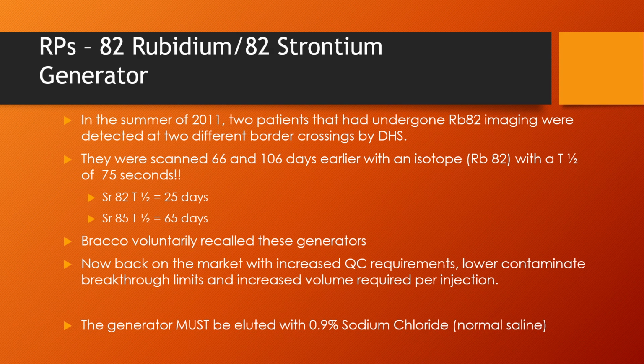The Bracco cart has a scanner that goes with it that you actually have to scan the saline. The system will double check that that really is saline and not any kind of lactated ringers or anything like that. So there's extra checks and balances now to make sure that patients are given sodium chloride.